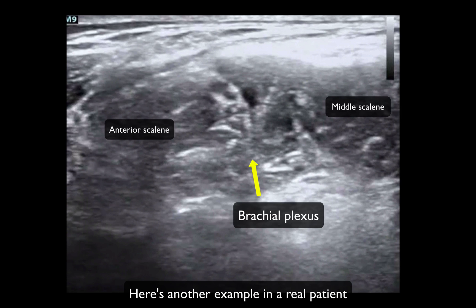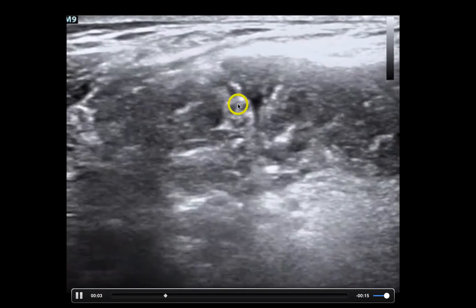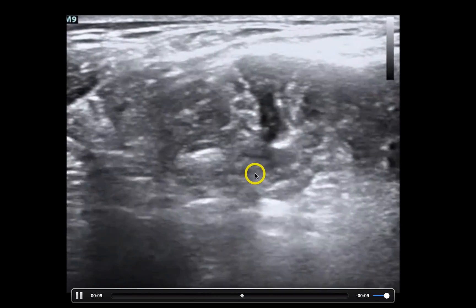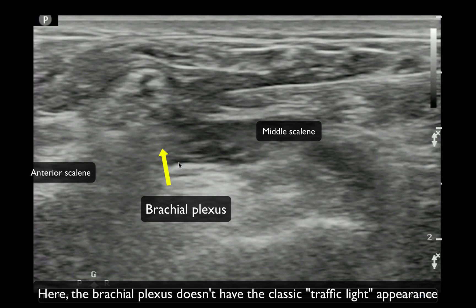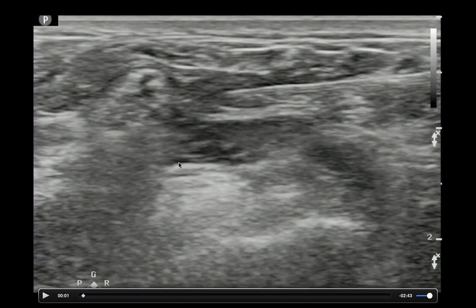Here's one done in a real patient. I don't have a great view of the entire needle, but the tip is easily visualized — a little triangular thing right here. You can see the hypoechoic fluid collection collecting here — this is the anesthetic infiltrating the interscalene groove. The brachial plexus here doesn't always look like that classic stoplight sign. As you move closer to the clavicle, it starts to look more like a honeycomb pattern. You don't necessarily need to be right where it's a stoplight, but if you see that classic stoplight appearance and you can get it there, you're more likely to get good analgesia for the shoulder and proximal humerus.